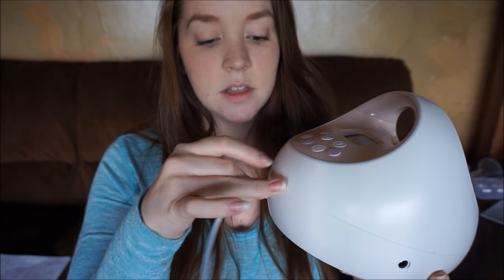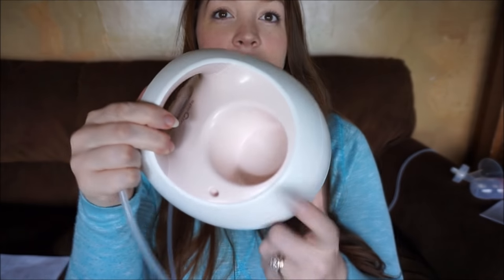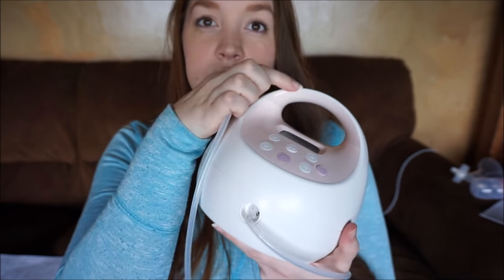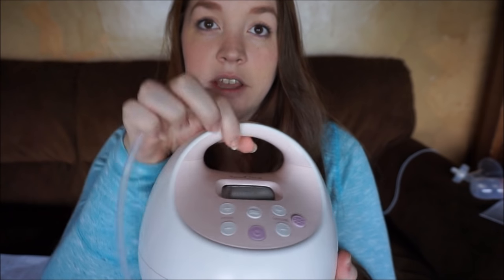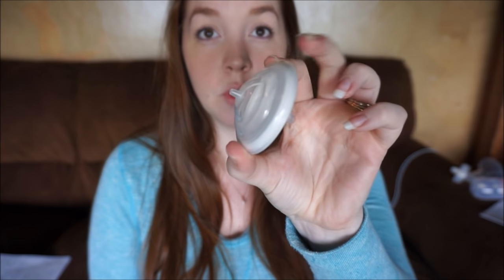This is the tubing port and it can be single or double. This is the tubing that goes with it, which is very generous — it's very long, which I like. In the back, it does have a cup holder and this is a handle. There is a nightlight underneath the handle. It also comes with two backflow protectors.